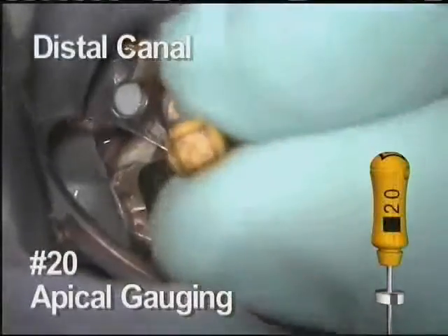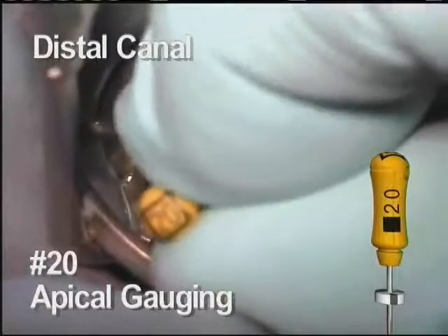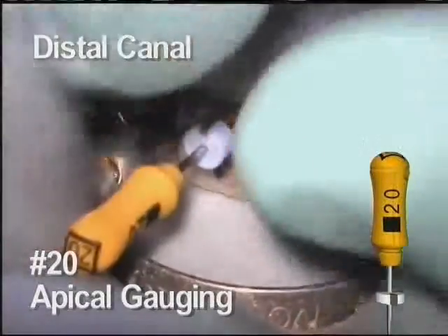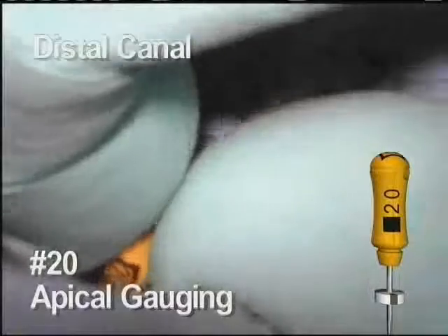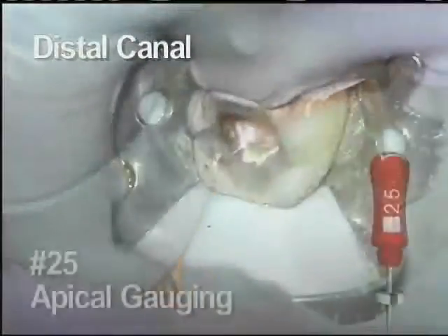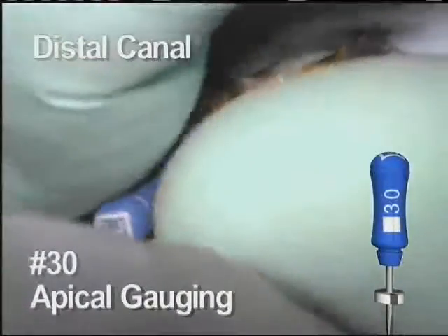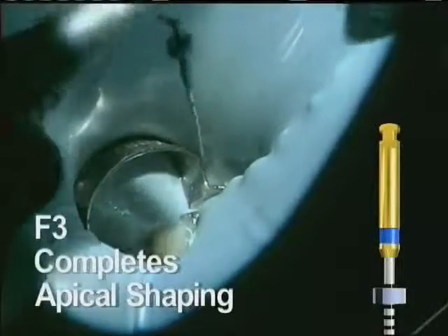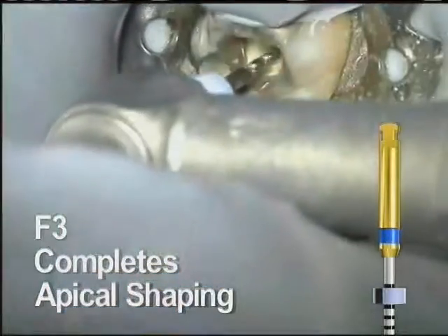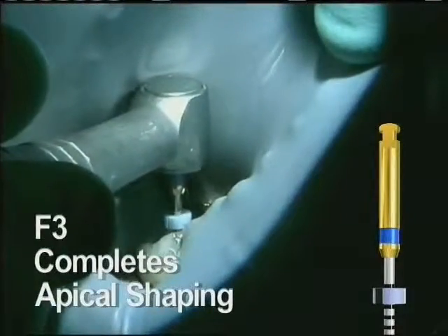To show canal variations, let's take a look at the gauging procedure of the distal canal of this same tooth. This canal followed the same instrumentation procedure as the others. The 20 is loose. The 25 is also loose at length. The 30 hand file will make it, but it is tight. The clinical decision is to use finishing file number 3 for apical shape here. The F3 is taken to length and removed, and the canal shaping is complete.